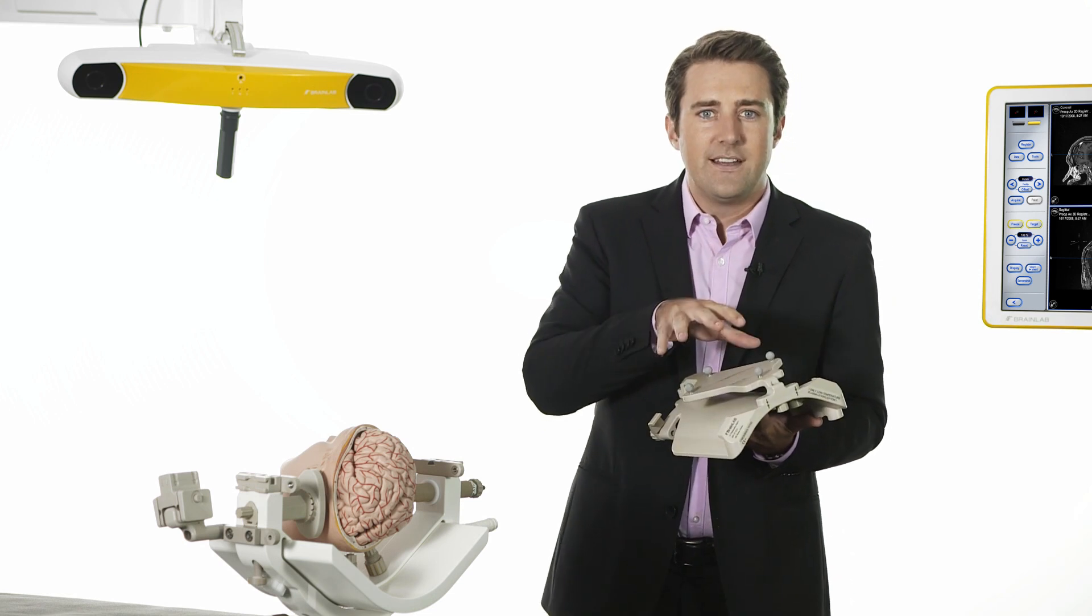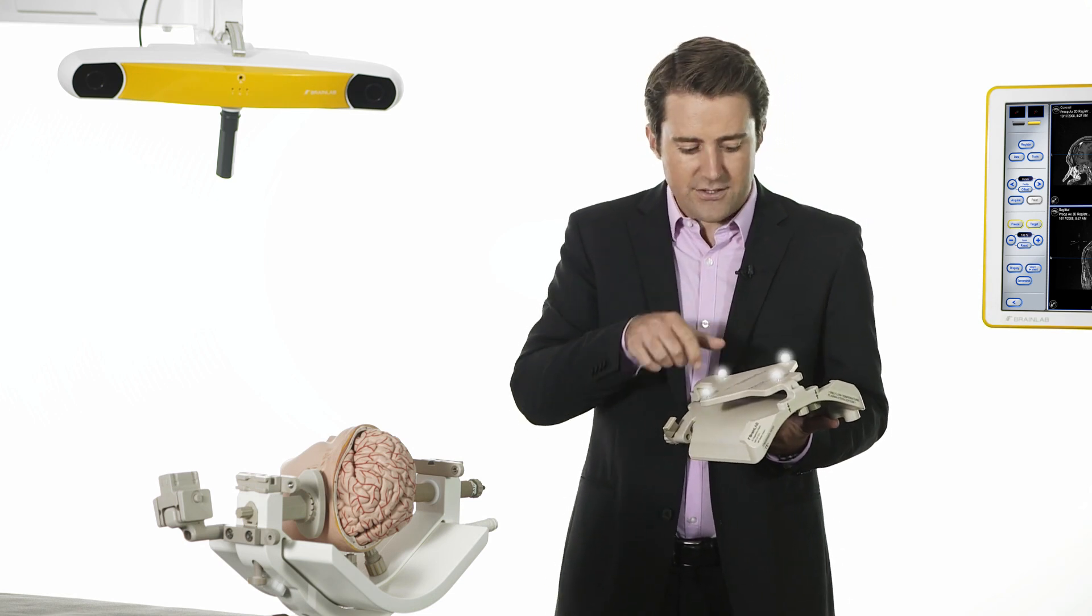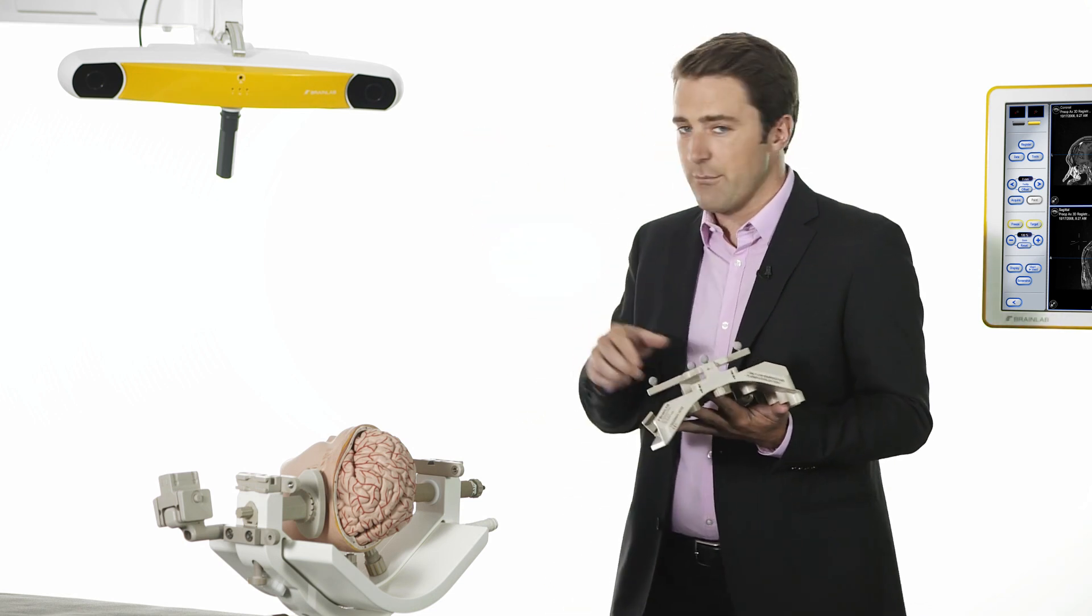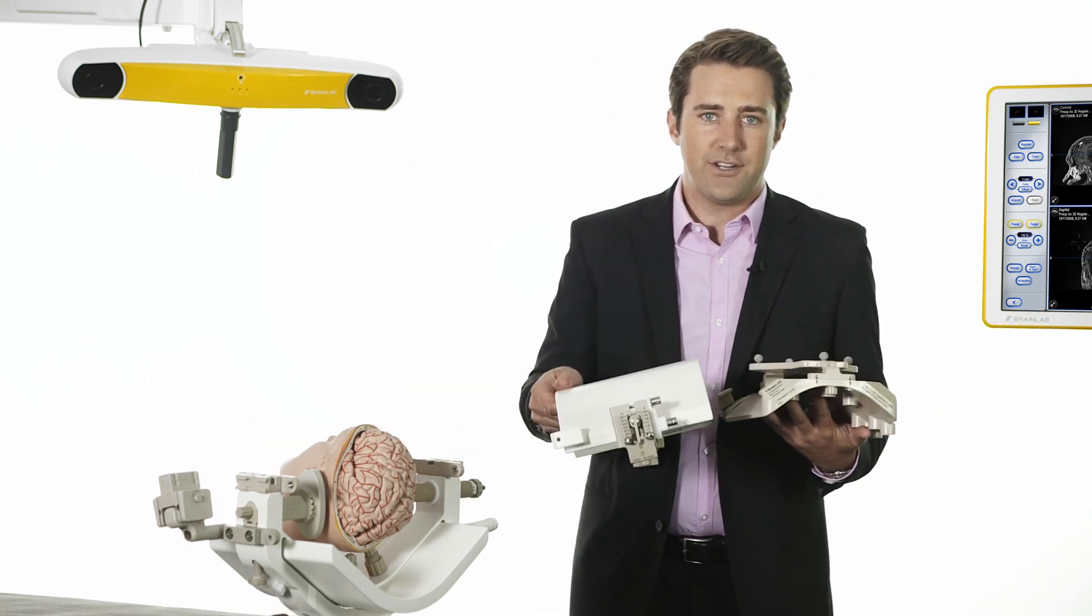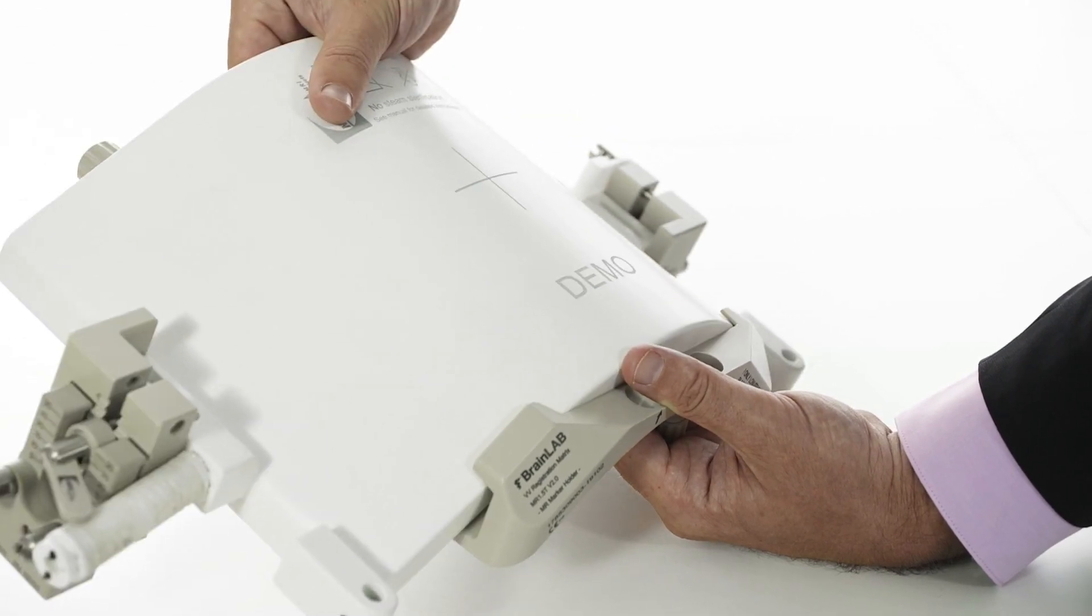The top of the matrix is fitted with reflective marker spheres, seen by the navigation camera. Rigidly attached to the top coil of the headholder, navigation and imaging components unite.